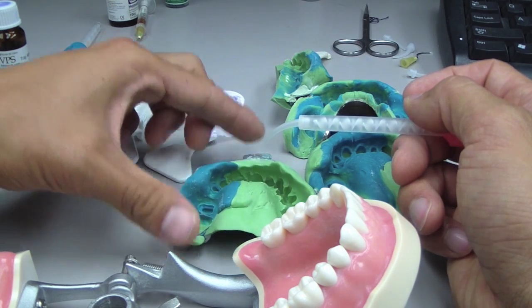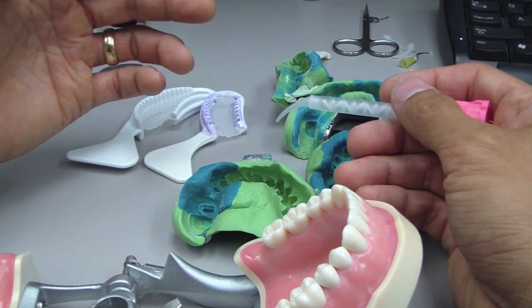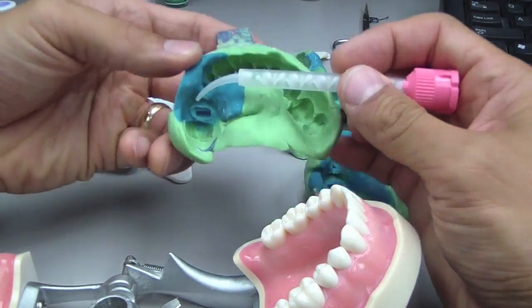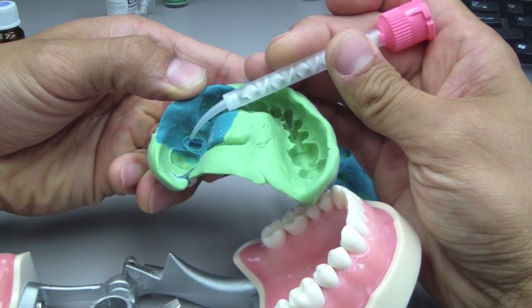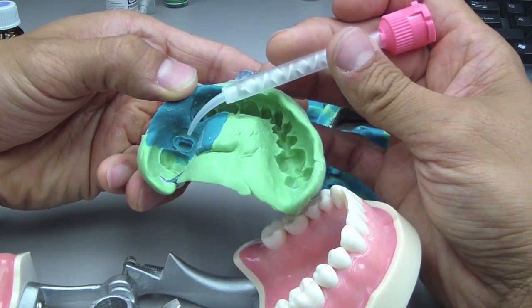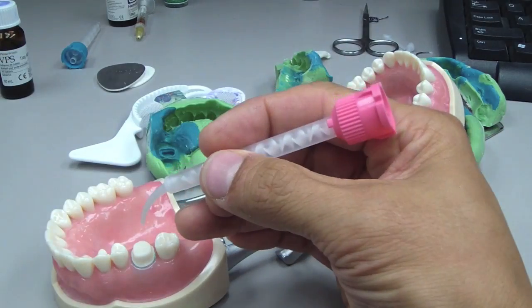The third concept is the impression technique — how are you doing it? One problem that we always have, and you can see even here, there's a bubble right on the margin. One tip from Dr. Dre was, in his experience, especially going around with whatever impression tip you're using, just keep your foot on the gas.